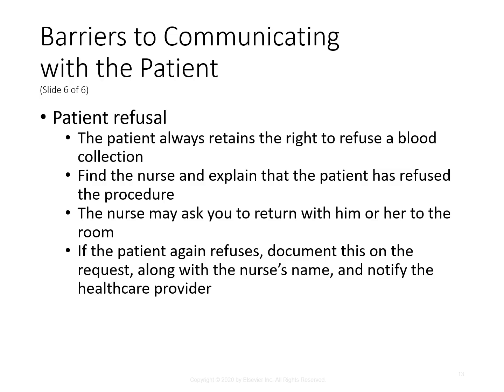Your facility may have a different protocol on that, so make sure you are aware of what that is. But most of the time, you're going to inform the nurse, and sometimes they'll talk to the doctor. Sometimes they're going to want you to call. It just kind of depends. But in either case, if the patient refuses, they refuse. You cannot force them to do it.